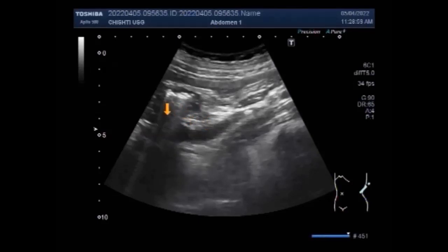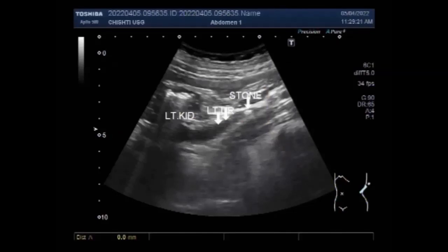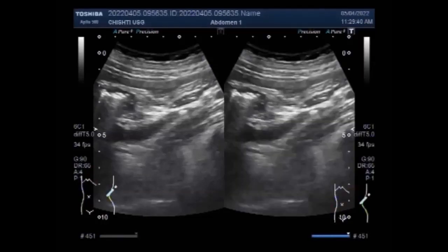This is the left kidney and you can see a stone; this is the ureter, and this is the stone — a small stone. The focusing of the ureteral stone requires a bit of practice in probe handling. You can see this is a small stone measuring about 6.2 millimeters. It has been focused, and another stone of similar size will be seen in the distal portion of the ureter.